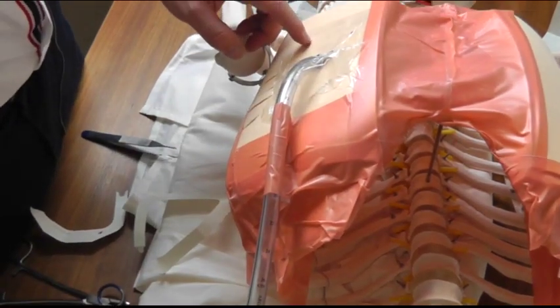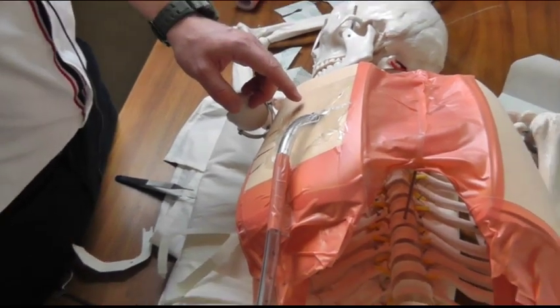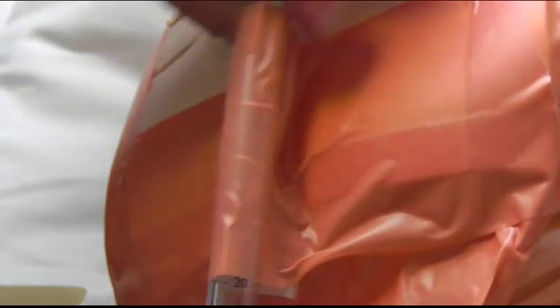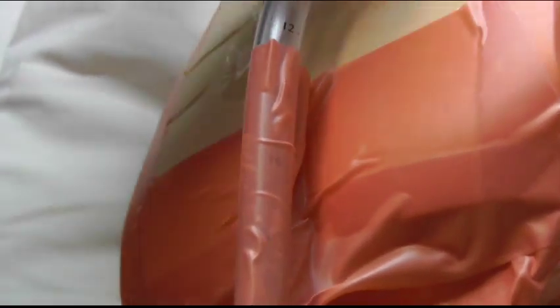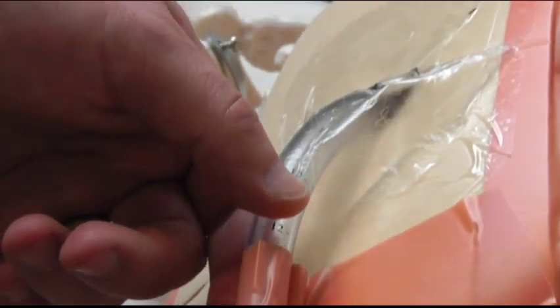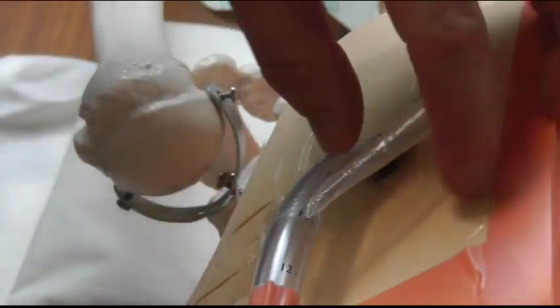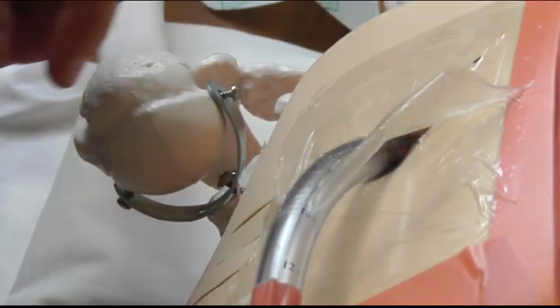It's well secured with your sleek on the mesentery dressing there, on a mesentery. It's also well secured at the top here. I'll just zoom in on the mesentery there so you can see it. So it's well secured with the tape bridge and if I pull on that it doesn't really want to go anywhere. And you can see there as well, the tube's not kinked but it's got a nice sterile dressing around it. No bugs can get in and if you've got your padding underneath that'll absorb any blood.